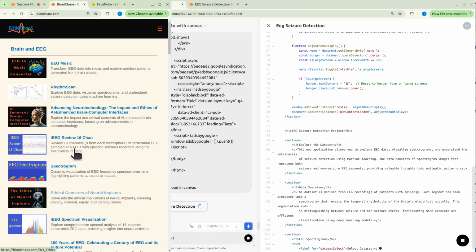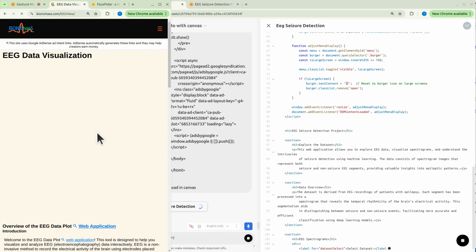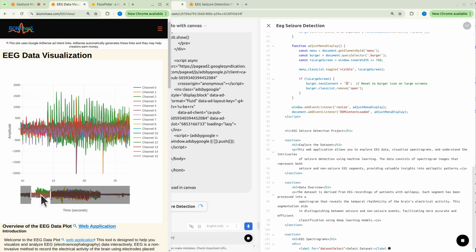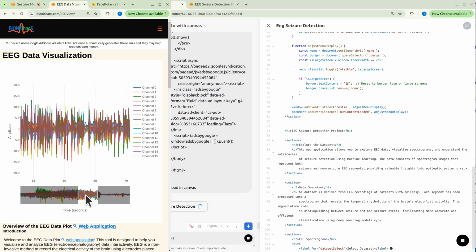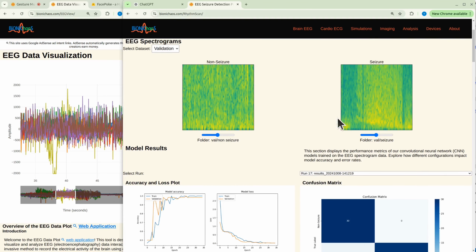Yeah, while it's generating, go check out the website. There should be a link in the chat. So that EEG was translated from time series into a spectrogram, and it also has seizures like this one. So that's where you have spiking. Normally that spiking slows down as the seizure progresses. That's what you see over here in the spectrogram, I think. I wish someone would have corrected me on that one.